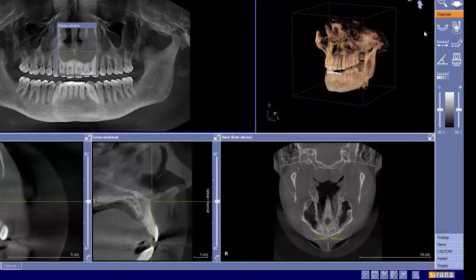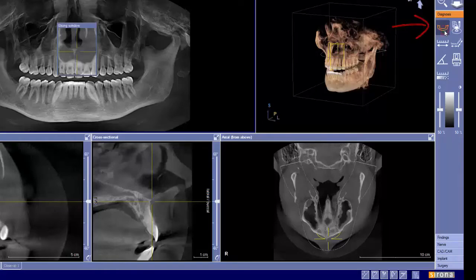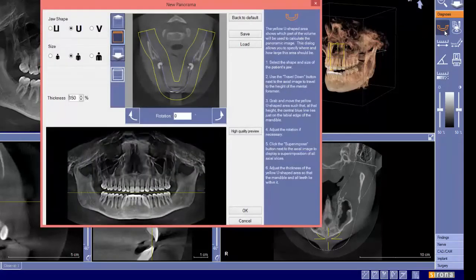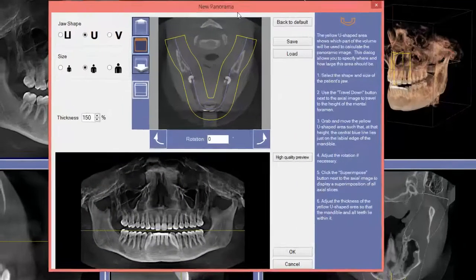For optimizing the pano, we're going to stay in diagnosis and select this mandible-shaped icon. Left-click on that one time. This opens up the new panorama window.